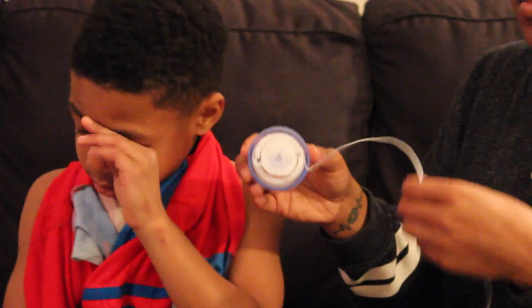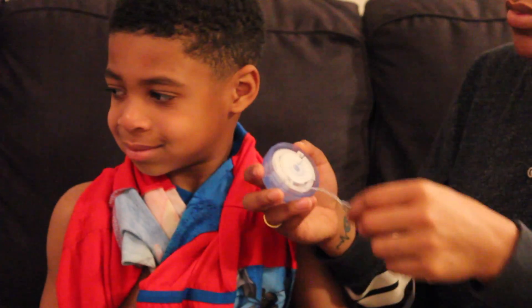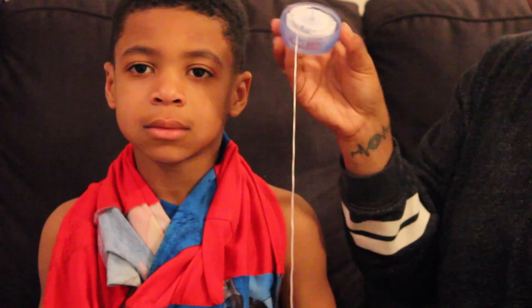Here I am unwinding the tubing in a counter-clockwise direction. There's a slot on the infusion set that the tubing is going to go in.